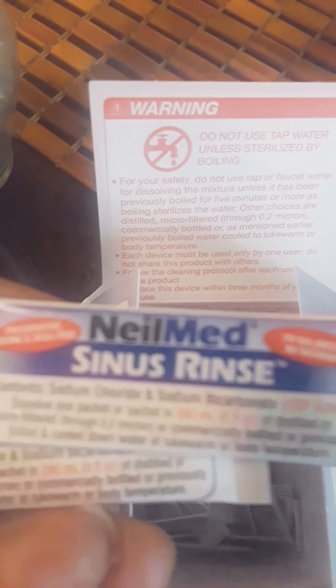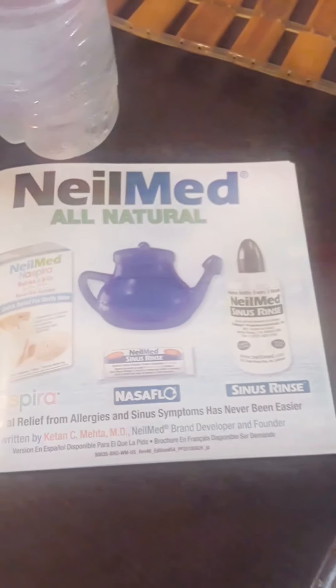When you open up the box, you can see you have 50 of these packets here — it's a sinus rinse. It also comes with the neti pot itself. Pay close attention to the shape of this because this goes in your nose and it fits perfectly. It also comes with an instruction manual.